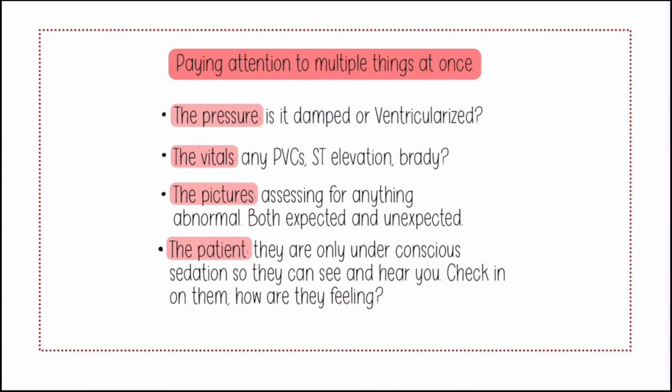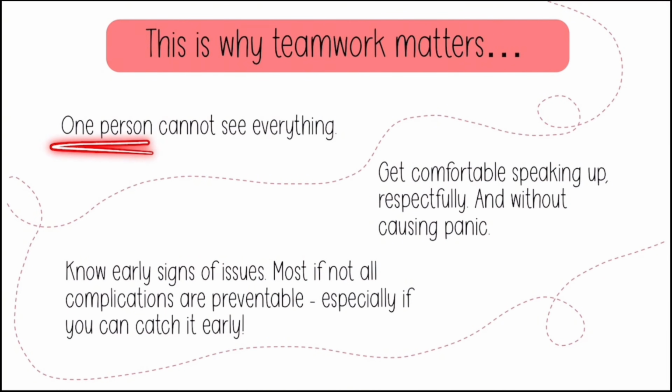As a monitor person, if no one ever told you that, you would assume the people in the room are paying attention to the vitals, but there might be certain points in time where you're the only one looking at that screen. So if you see something abnormal, you need to say something. Don't assume that somebody else saw it. And this is why teamwork matters.